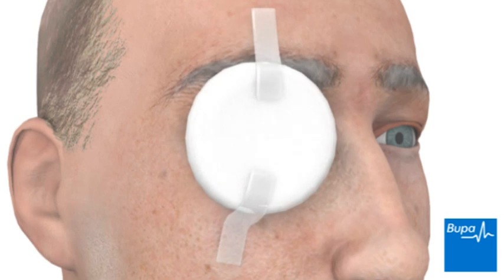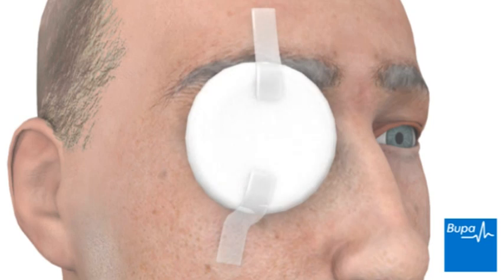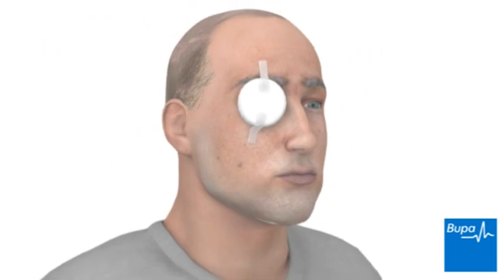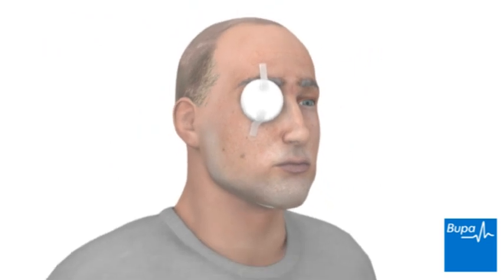Your eye will be covered with a dressing to protect it. You'll need to wear the dressing over your eye for a few hours after your operation.